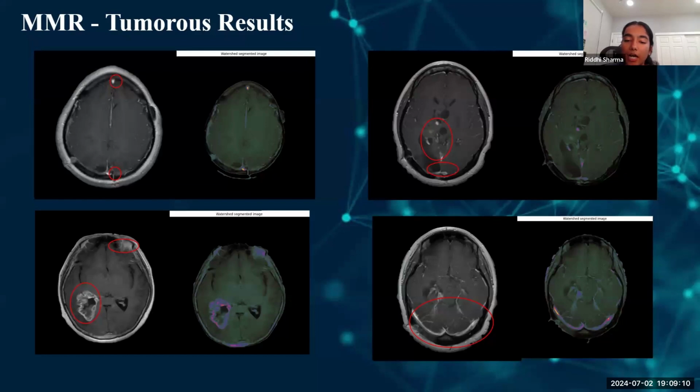And we plan to add this algorithm to our model because the tumor diversity in our data set is huge. And as the MMR is a less strong algorithm that doesn't go through expensive computation compared to our deep learning algorithms, we will use the scans with more vibrant tumor gray ranges for this model.